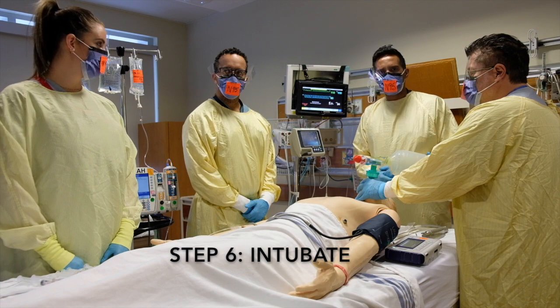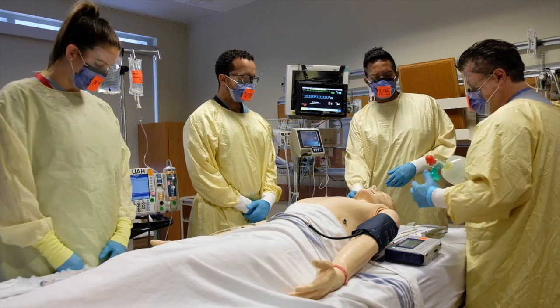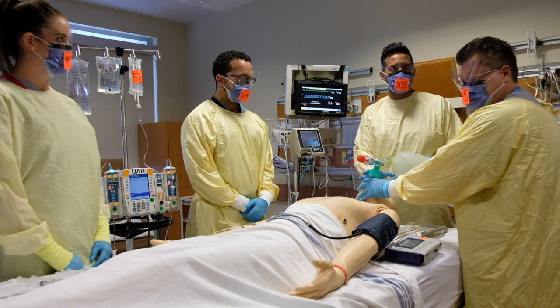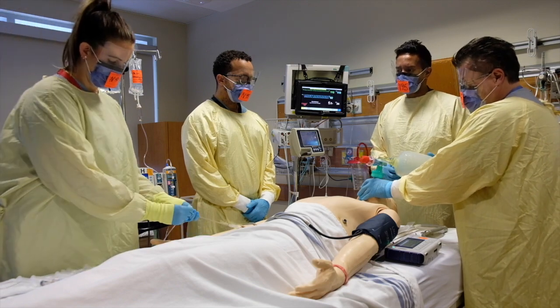So now that we've gone through our checklist and the patient is prepared, we'll continue with intubating. As you can see, the patient is on 15 liters via high-flow nasal cannula. And we've also put the bag valve mask on top with flushed oxygen, but we're not bagging so that we do not aerosolize anything into the environment. We will then proceed with rapid sequence induction for this patient.